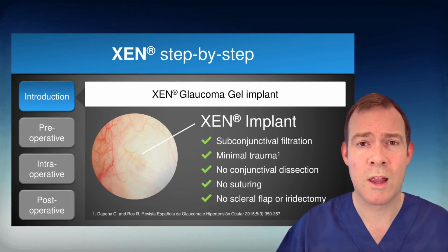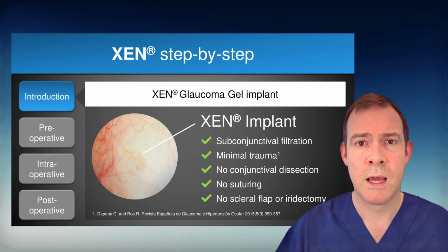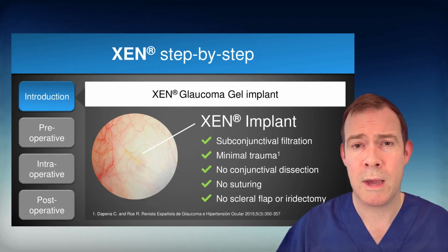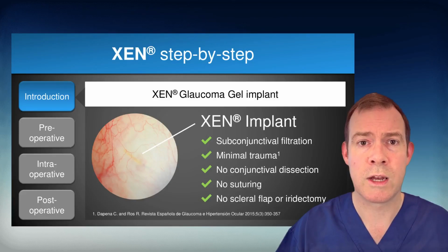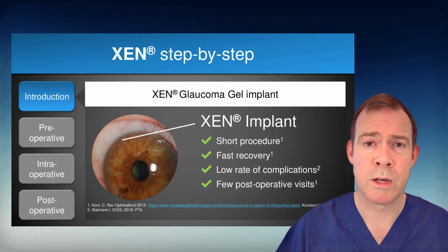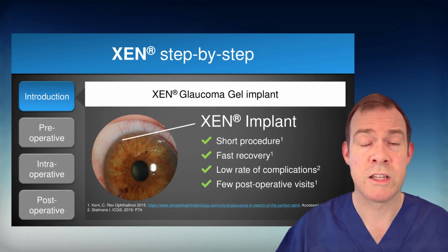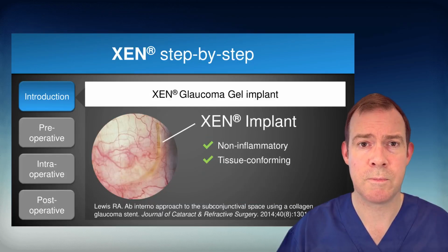It enables us to utilize the proven route of subconjunctival filtration, but in a procedure which is much less traumatic than conventional surgery. There's no need to perform open conjunctival dissection, similarly no suture, and no need to create a scleral flap or iridectomy. This results in a procedure which is shorter, which has a fast recovery for the patient, with a relatively low rate of complications and fewer post-operative visits compared to conventional surgery.